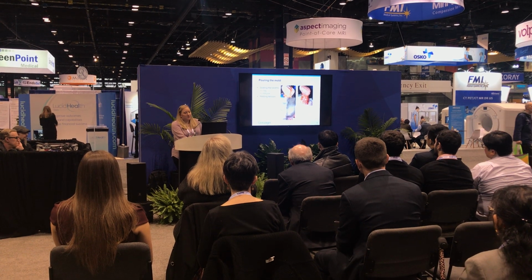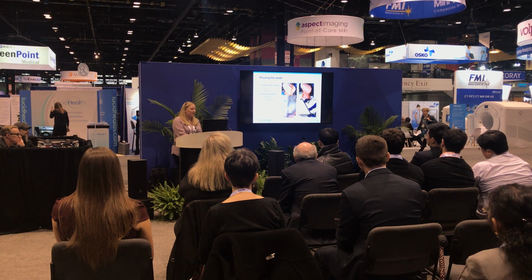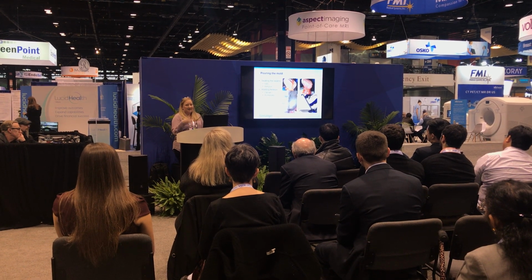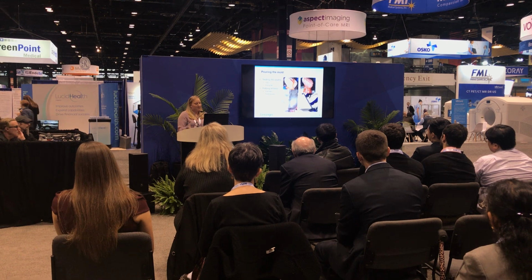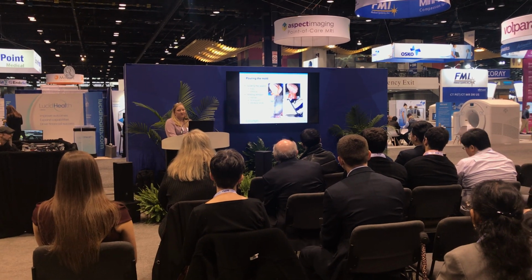The other thing you wanna do is hold tension on that mold. We've used clamps, and as you can see, we've used tourniquets too. Our print lab is right next to CT, and since I'm radiology based, I just tend to use medical supplies. So the first couple of times I just put tourniquets on. But honestly, it's whatever works for you guys.